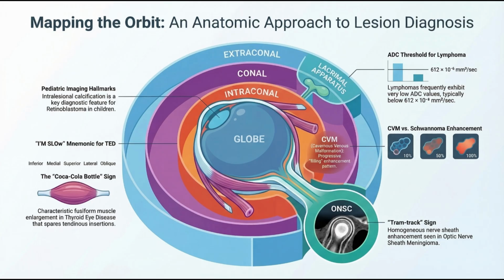Think of normal, healthy tissue, like a wide-open ballroom where people are dancing freely. Water molecules are the people. They can move around easily and spread out. Okay, I can picture that. Now imagine a highly malignant tumor like rhabdomyosarcoma. Because cancer grows out of control, it packs cells in as tightly as possible. It fills the room. Now that same ballroom is packed shoulder to shoulder with thousands of people. No one can move a muscle. That's what happens to the water. It's trapped by the dense wall of cancer cells. Ah, so it can't flow.